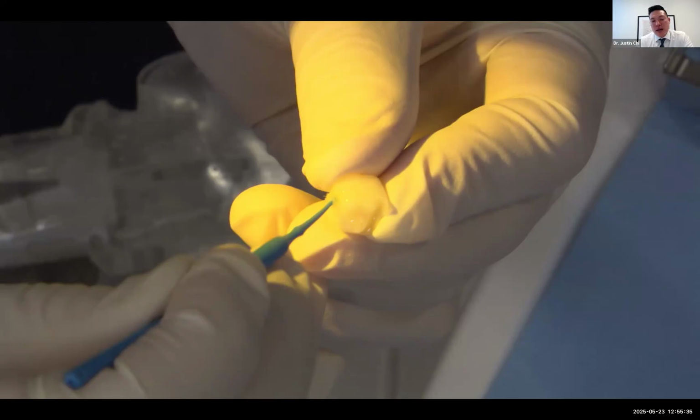And now we're going to apply our bonding agent. The bonding agent gets infused. We're relying on this micromechanical retention to enhance the bond. We use a universal bonding agent, 3M Scotchbond Universal. There is an additional silane embedded within the chemistry that will chemically adhere to any of the glassy matrix on the CAMouflage. So that's an additional benefit to using a universal bonding agent that contains silane.